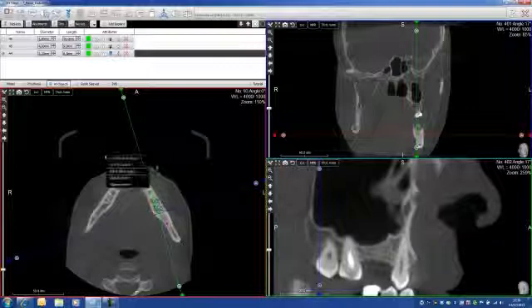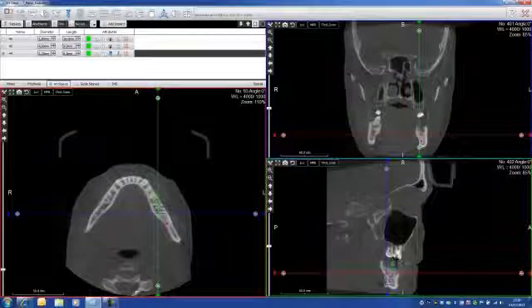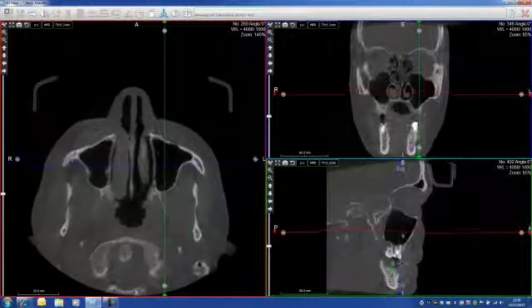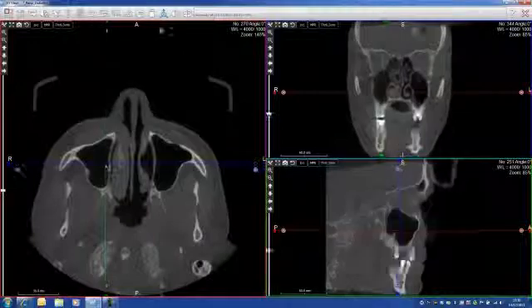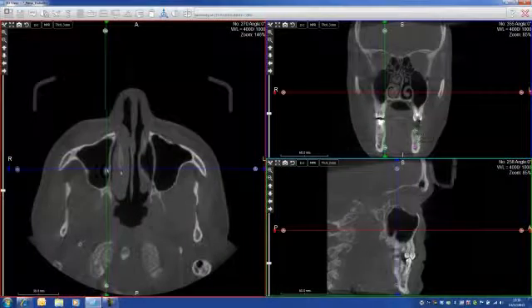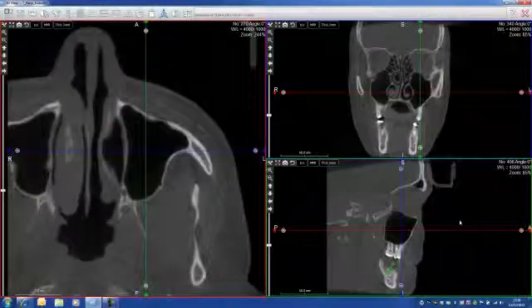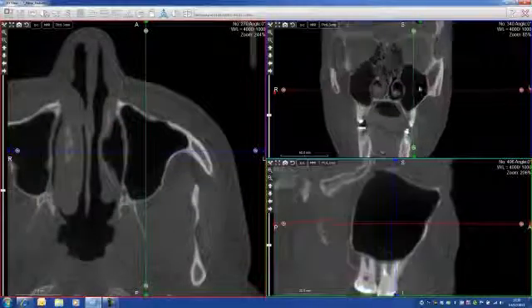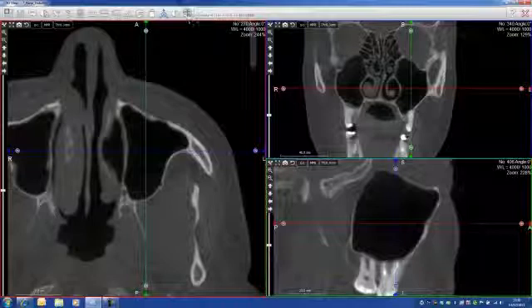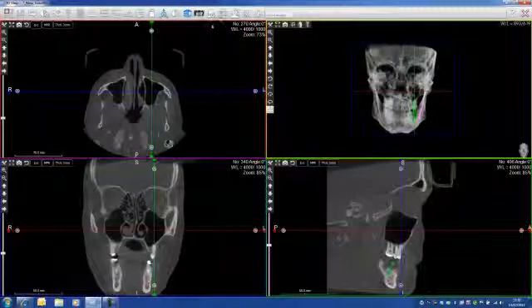I go reset view. I close this for now, I don't need it. I go on the sinus, all the different views. And what I'm going to do now is simply zoom in, and go on this little icon — 3D.